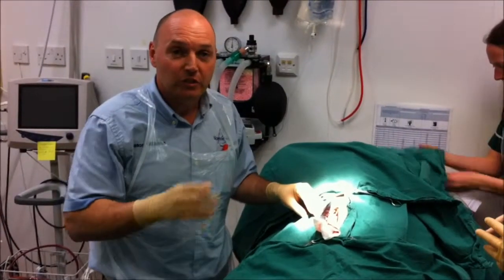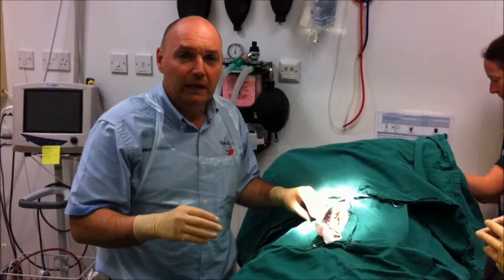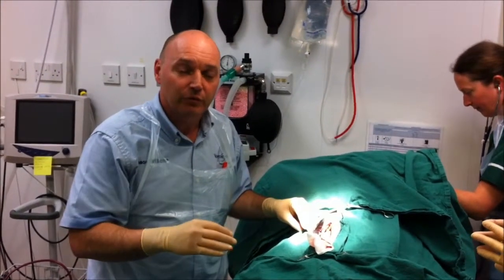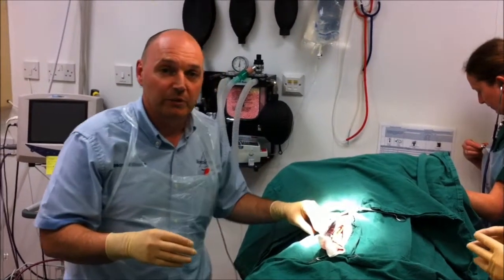We're just about to start an operation on this bitch who's got an infected uterus called pyometra. We've just made the incision through the skin and we're just about to start to go through the muscle to get to where the infected uterus is, which is inside her abdomen.